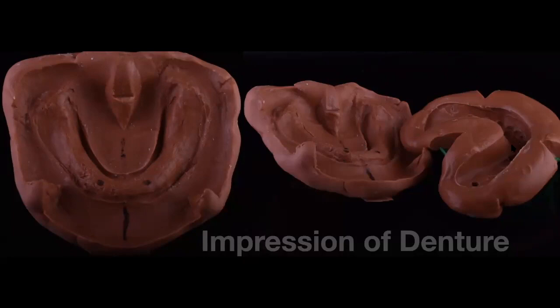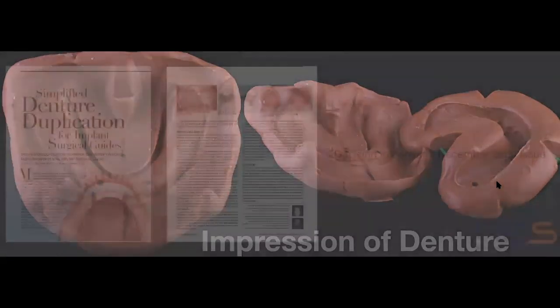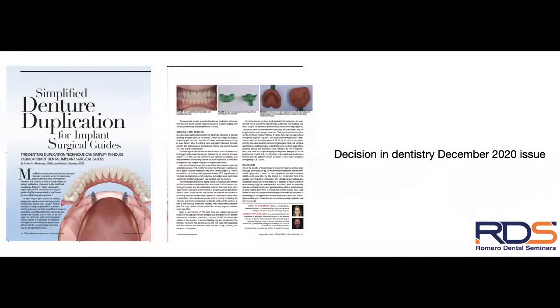And what we're going to do now is mix some orthodontic clear acrylic, and we're going to place it within this aspect of the denture, the tooth side or the tooth impression of the denture. And then we're going to fully sit it. We're going to make sure that this fully sits on top of it. We're going to lock them with some rubber bands, and we're going to allow that acrylic to set. And what you're going to end up having is a clear denture.